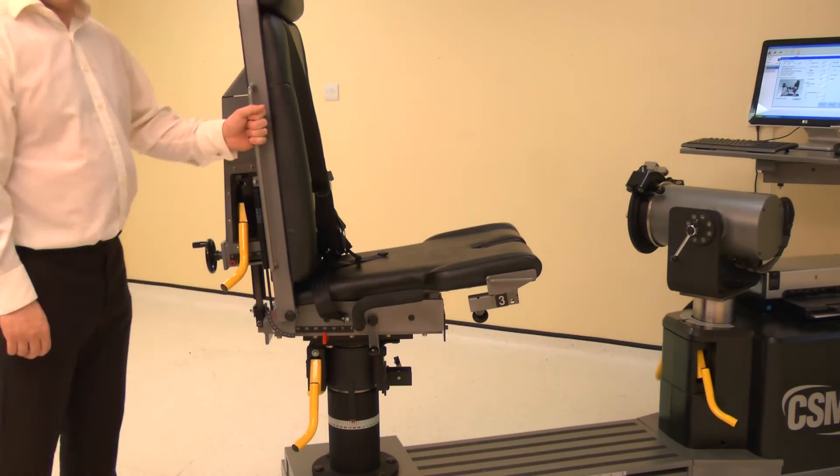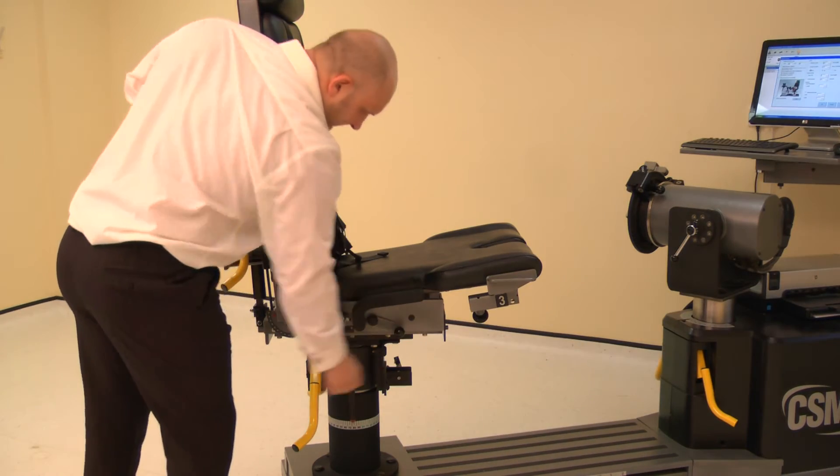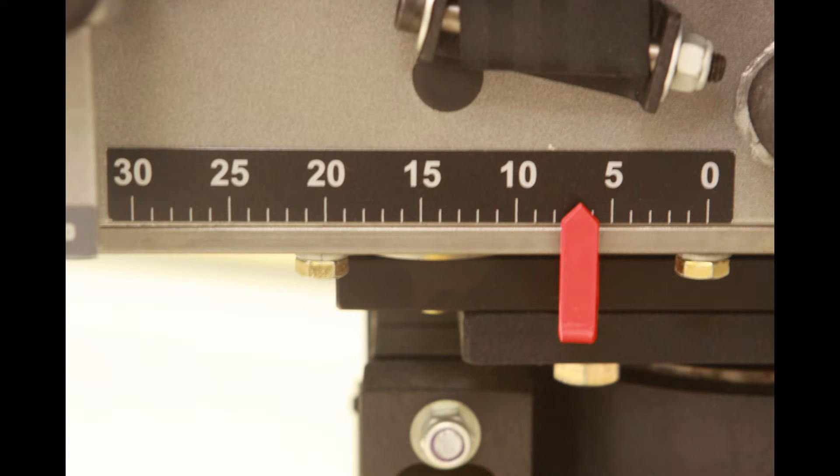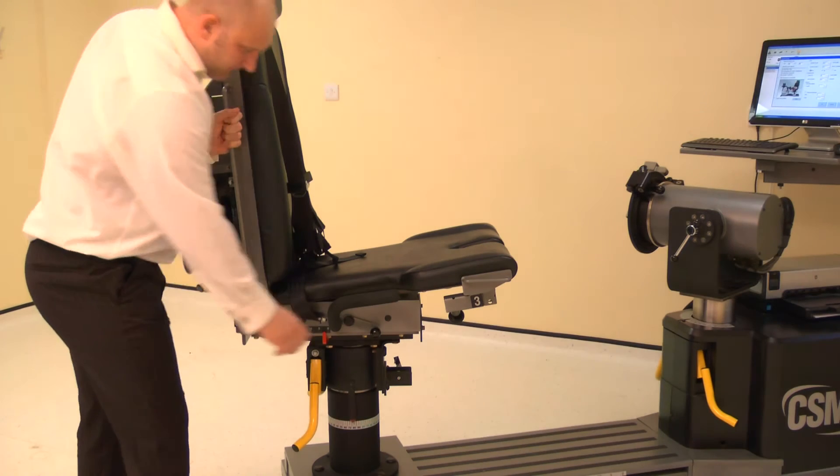The chair fore-aft is altered by raising either locking handle, then slide the chair bottom forwards or backwards. Adjust the fore-aft to position 7. Lower the locking handle to secure.